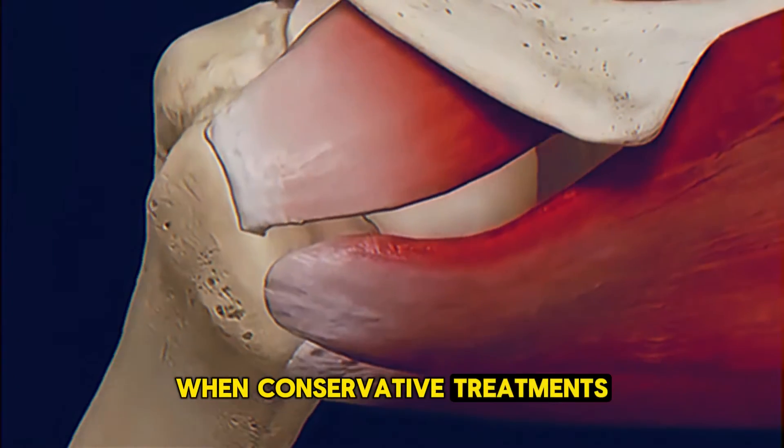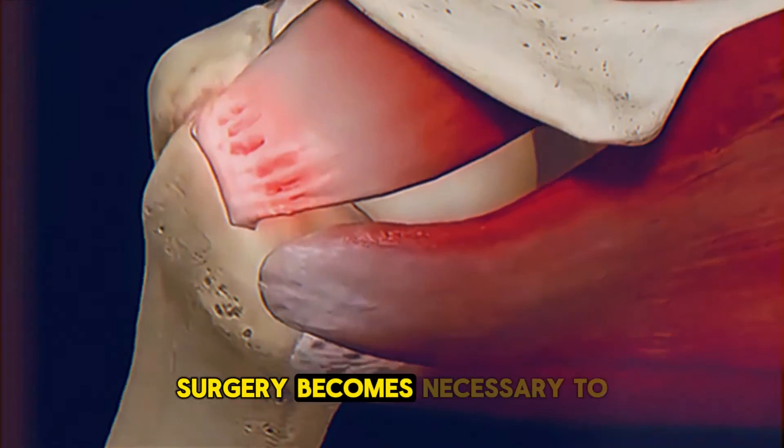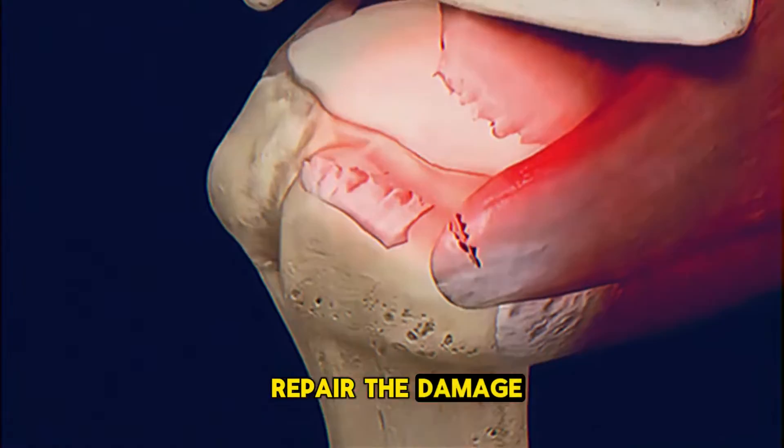When conservative treatments like physical therapy or injections don't provide relief, surgery becomes necessary to repair the damage and restore function.